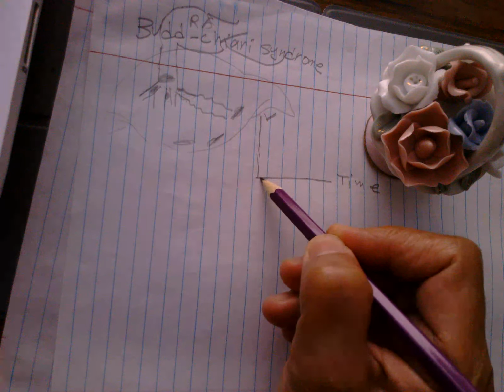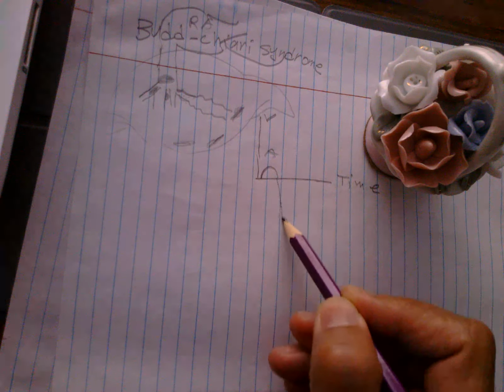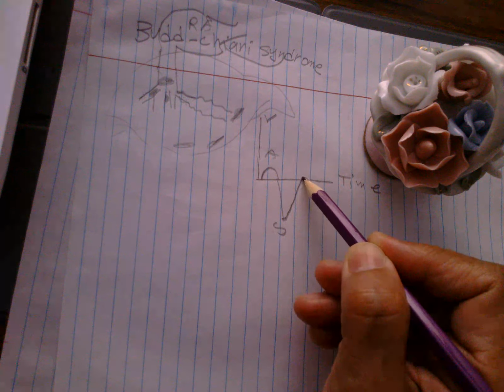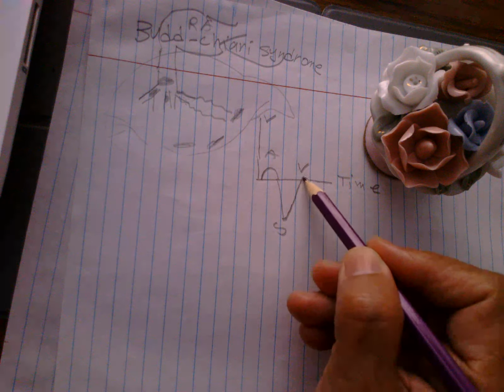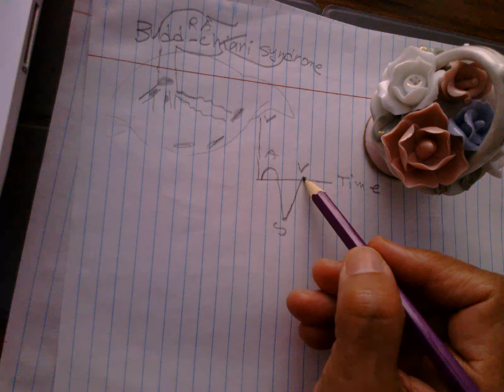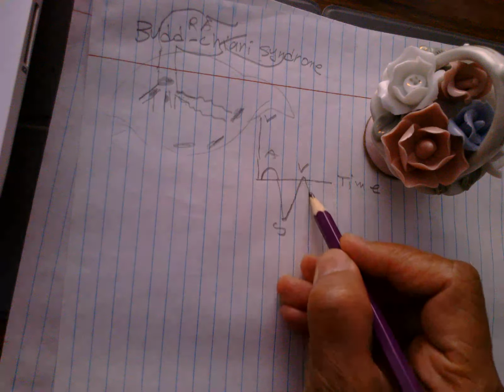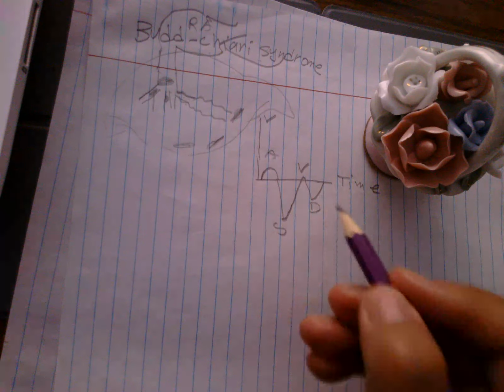It is pulsatile. Atrial contraction, systolic contraction, ventricular systolic contractions, and then the isovolumetric wave of relaxation of the right ventricle when all the valves are closed, and a kick of the right ventricle to the right atrium, and then diastole that is smaller than the systolic wave.